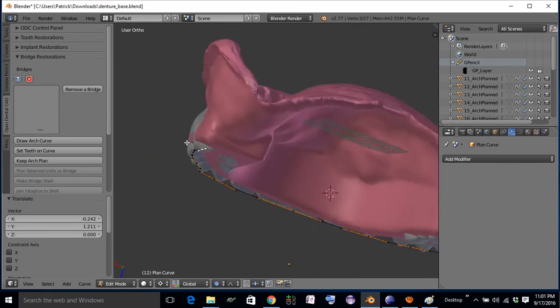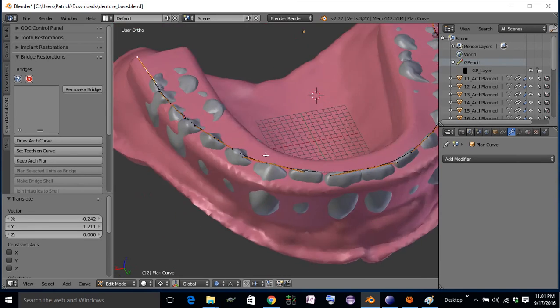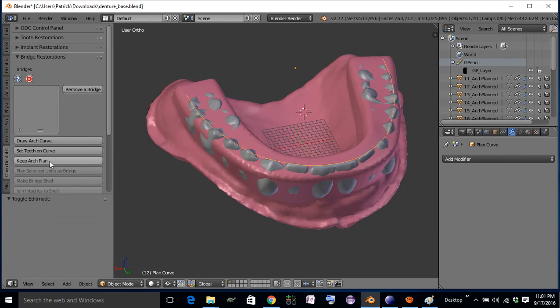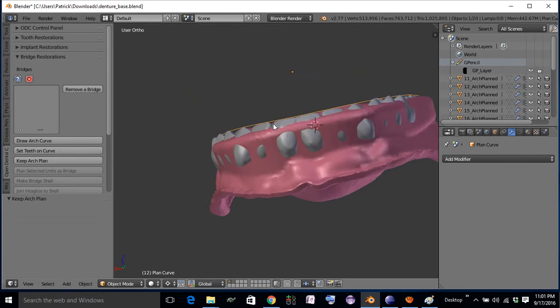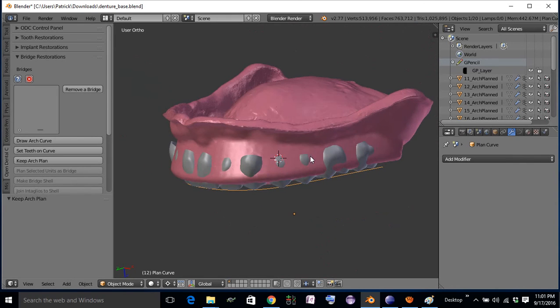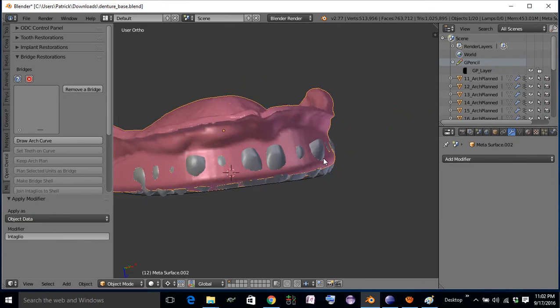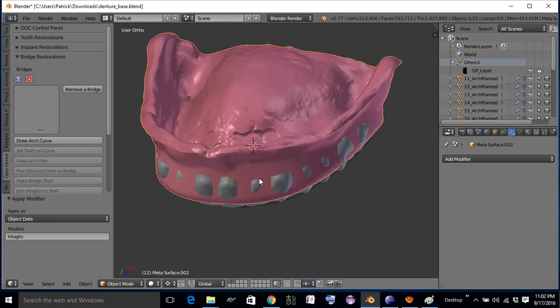From here, you can go back to your drawArchCurve — remember this function sets the buccal cusps and incisal edges of the teeth on the arch curve. From here it becomes a lot easier to sculpt your gingiva around the teeth. Before you go into sculpt mode, you need to apply that modifier. And now you're ready to go.